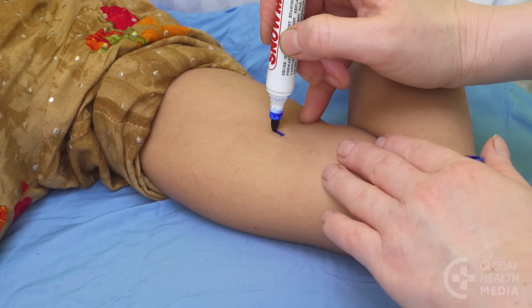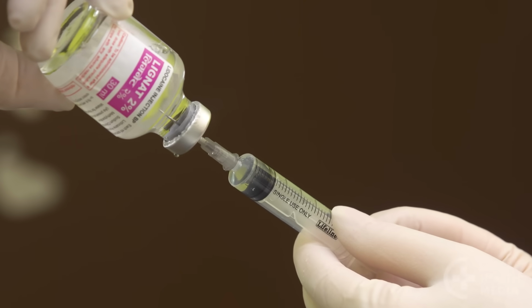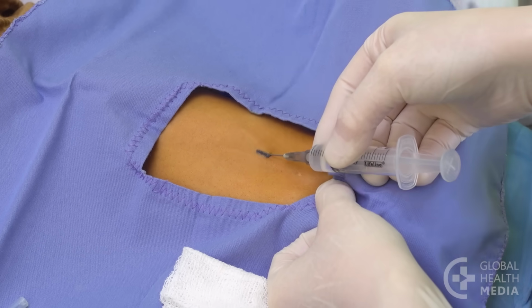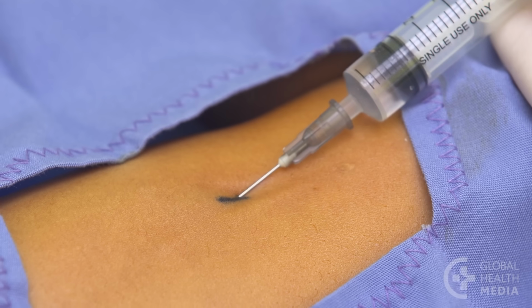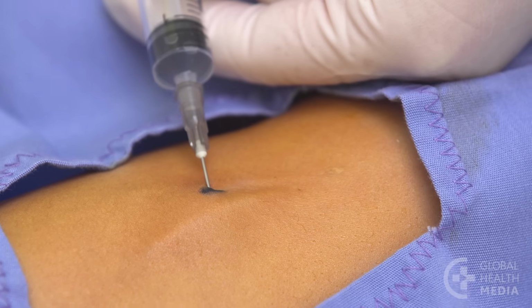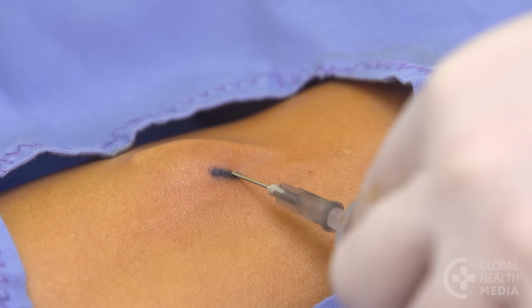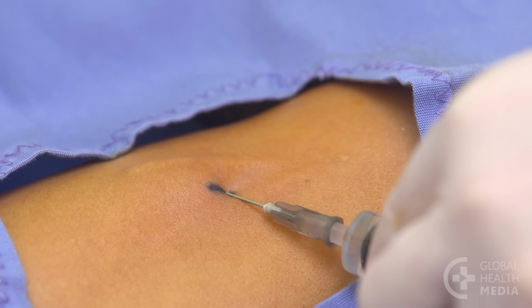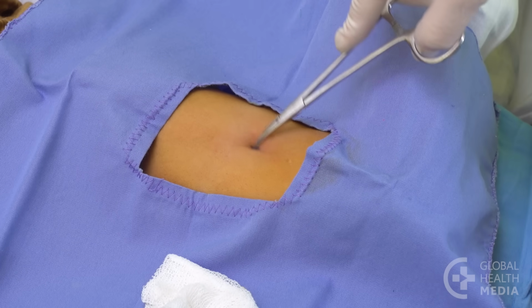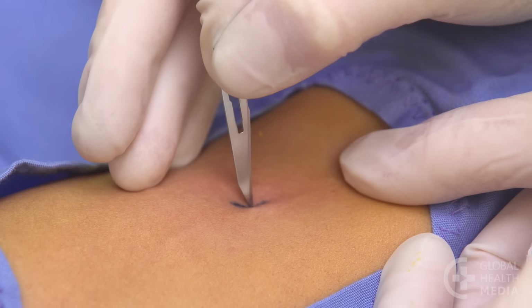This is a 2-rod removal. Draw up 1.5 milliliters of lidocaine. Inject equal parts at the incision site and under each rod. Check that the site is numb. Then make a 4 millimeter stab incision at your mark.